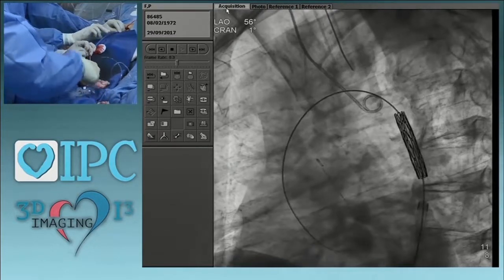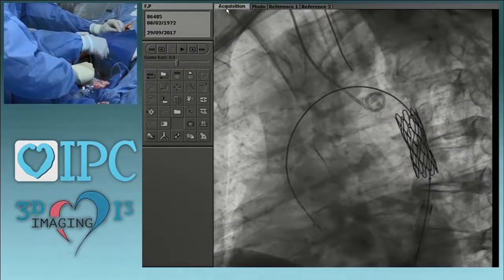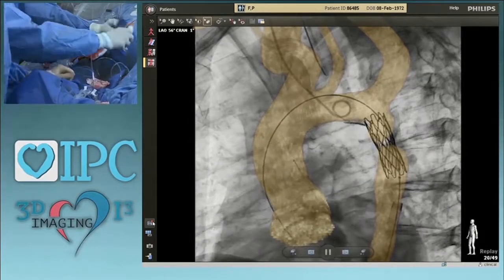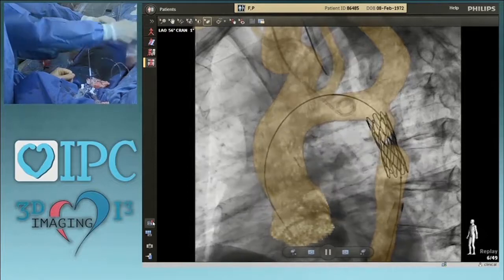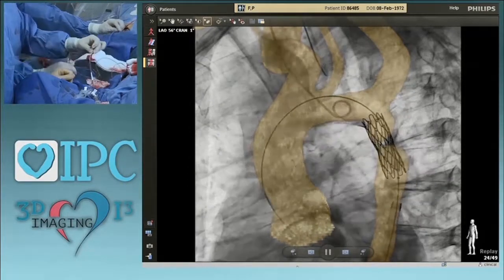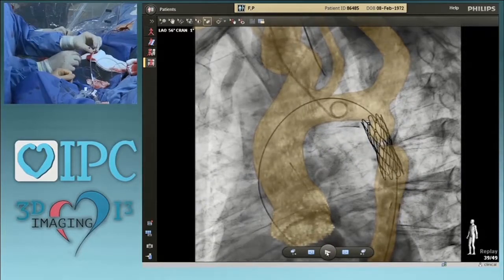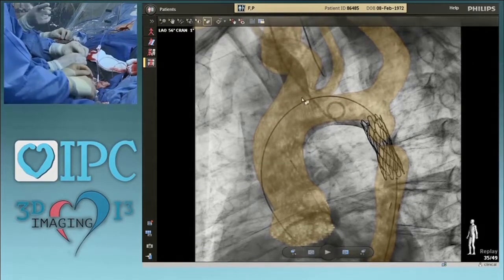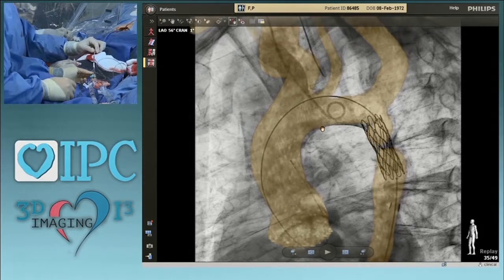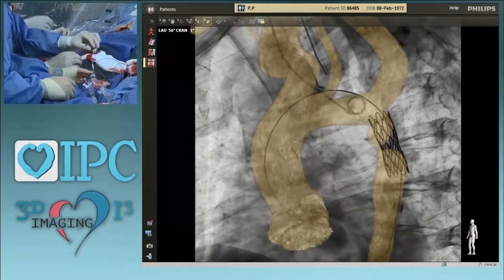Why did you do an angio immediately from the bag? Ready to inject? Okay. That looks very good. I know you'll do a bigger injection. Can you just measure pressures for us real quick? Because we're getting close to the time where the lunch session starts and we still have Oliver left out in left field here. So can you give us the pressures quickly and then take whatever injection you're going to do?